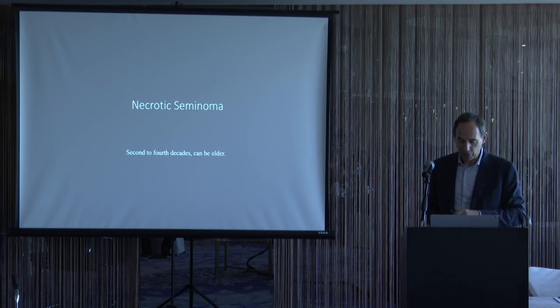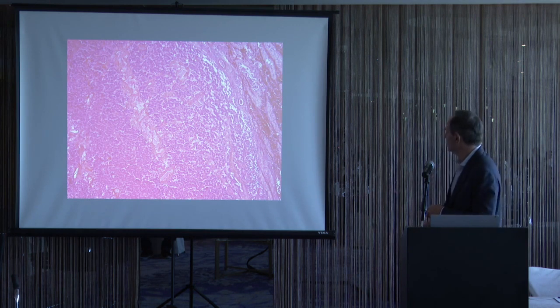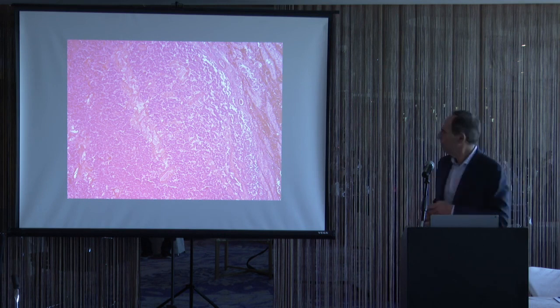So necrotic seminoma is basically the same age range as regular seminoma. And it's just like the case I showed you yesterday. This was a case where actually a pathologist did not recognize that this was tumor. And unfortunately, the patient developed metastases and it became a medical legal problem. But what one sees here at low power is dead tissue.